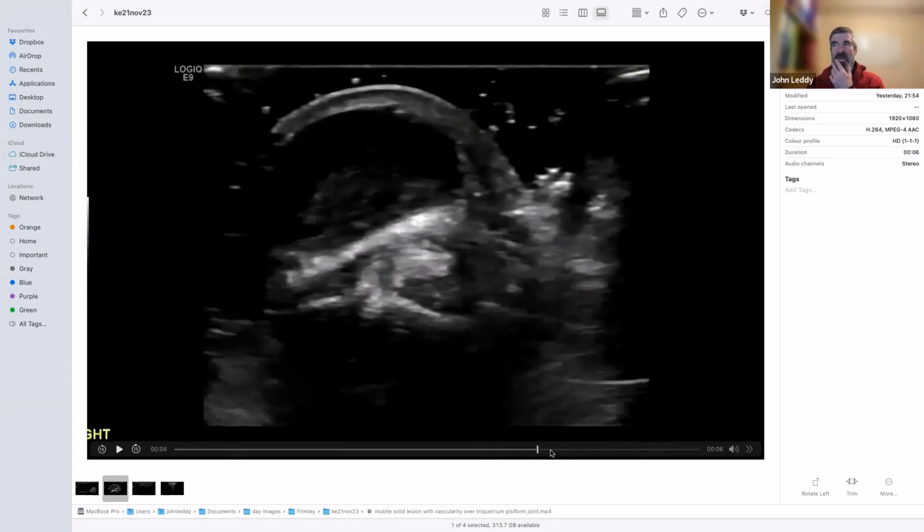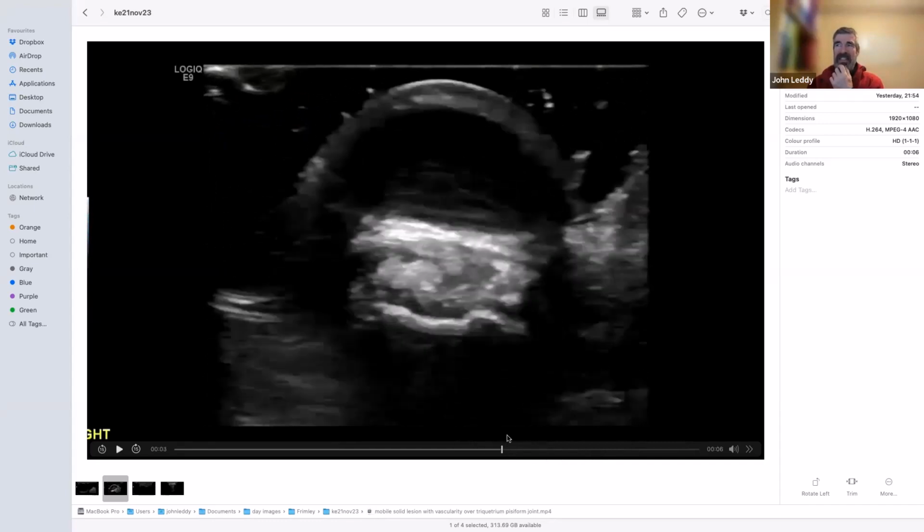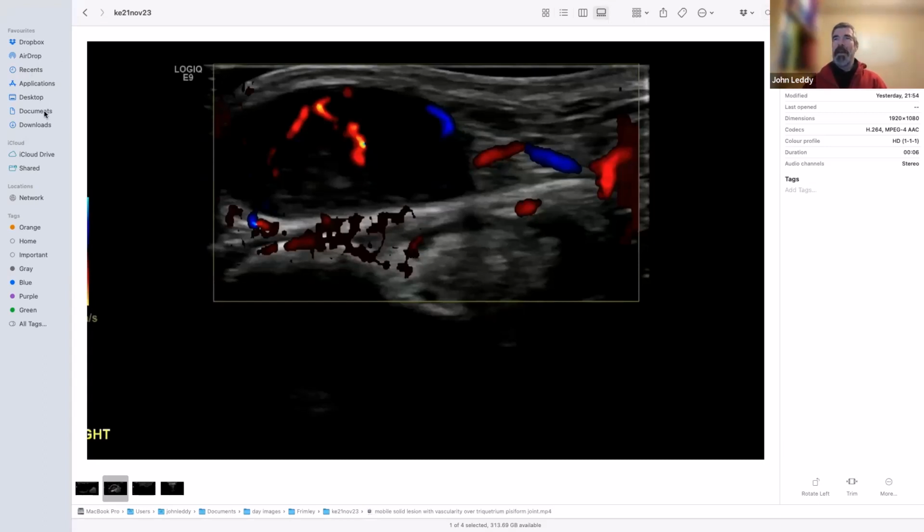But you would not expect that to have blood flow in it, and wow. You have to look really carefully to see blood flow. And some of these vascular malformations don't have any blood flow in them at all, because they're mostly blood in convoluted vessels, they actually look very, very dark with very little solid elements to it. So it's just somewhere where you have to be careful, and you have to know and trust your kit and turn the gain right up. So you can get caught out by that.